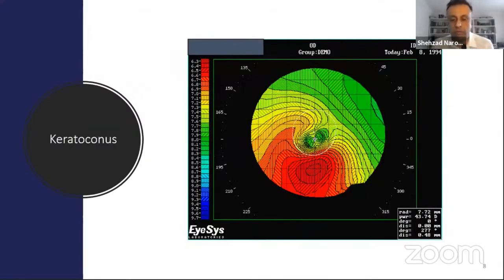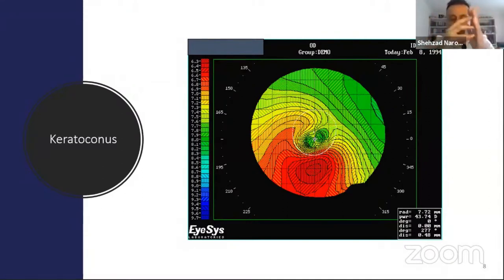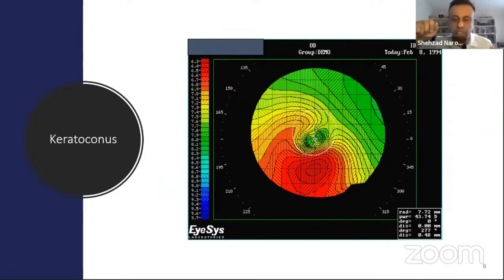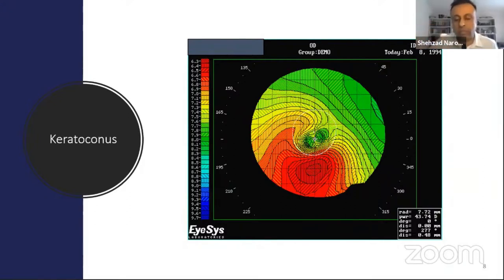This is a keratoconic patient. In keratoconus — an ectatic condition — the cornea steepens around the apex. I was taught to think of the balloon model: imagine a balloon full of air with a point pulled outward; you get a steep apex but stretching elsewhere. In keratoconus you see the inferior part becoming steep and the superior part stretching and becoming flatter, as the corneal dynamics pull the cornea forward, creating this protrusion.